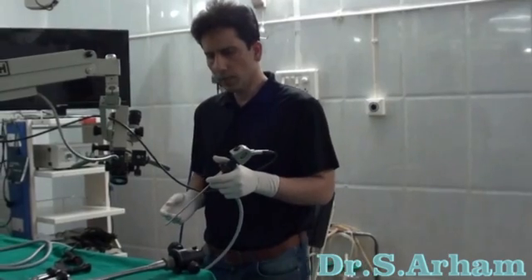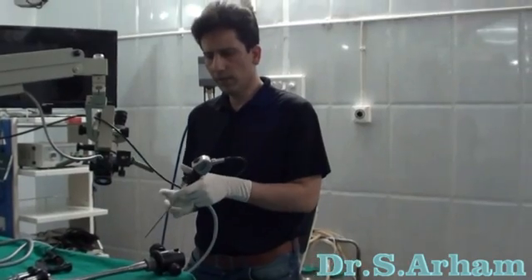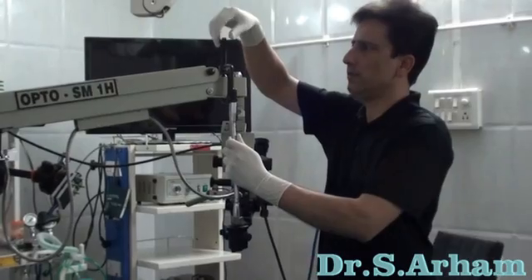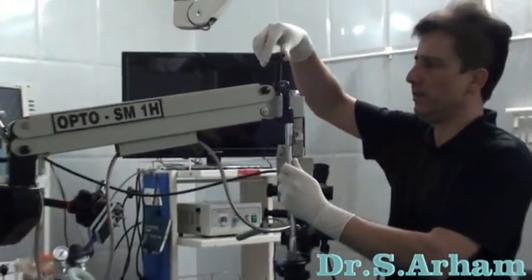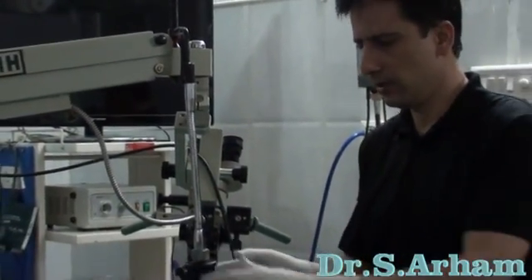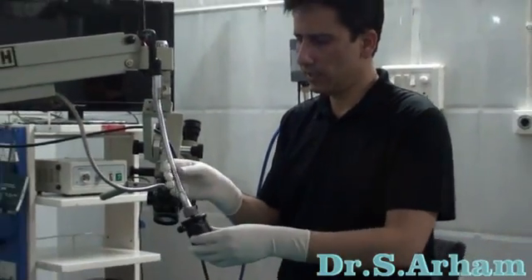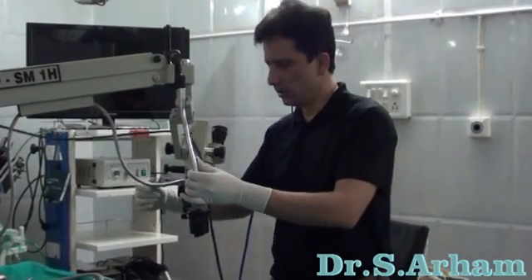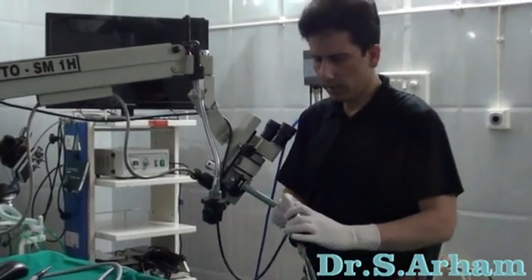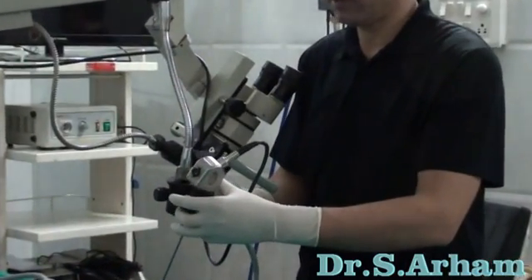Initially, I had designed a holder for my endoscope. The first endoscope holder which I had designed is a clamp — you fix it like this and you fix your endoscope on a special holder on it. It was mobile, it was used alongside the microscope, and initially it was good enough for my initial work.